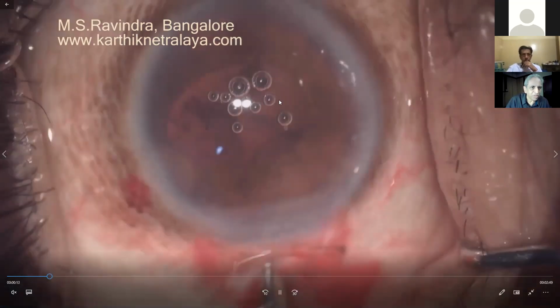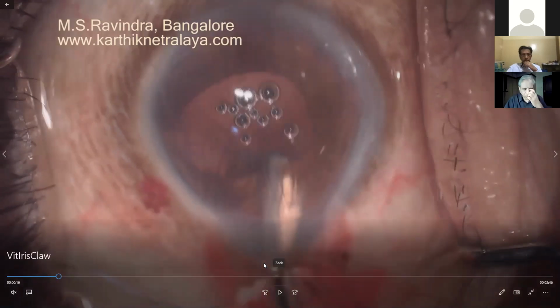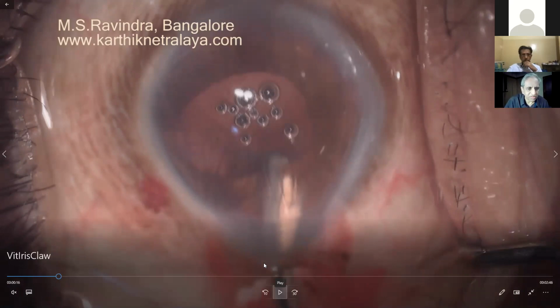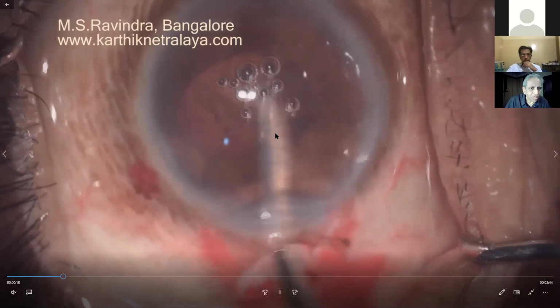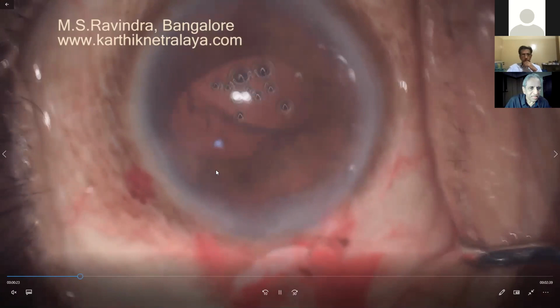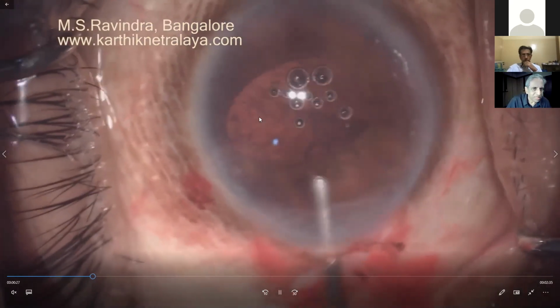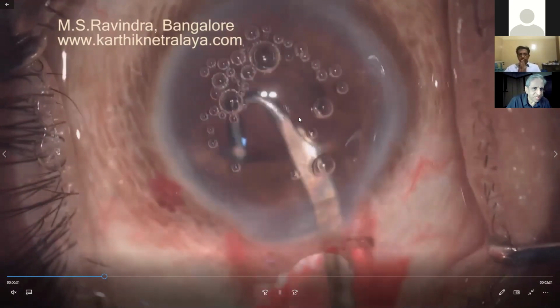I've just come out. I would not like to remove the cortex using the vitrectomy probe for various reasons. I would always like to take back my Simcoe cannula, as you can see here. So there is some cortex which is hidden under the pupil. And then you can observe the capsule as it flutters there. That means vitreous is still coming out.